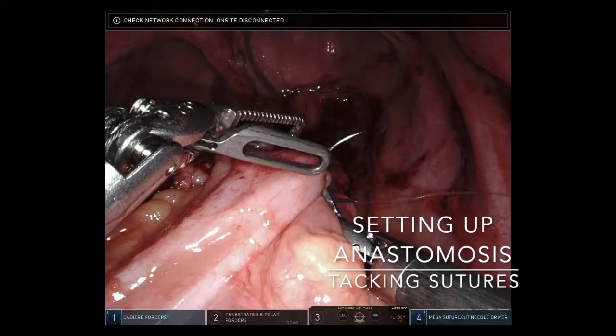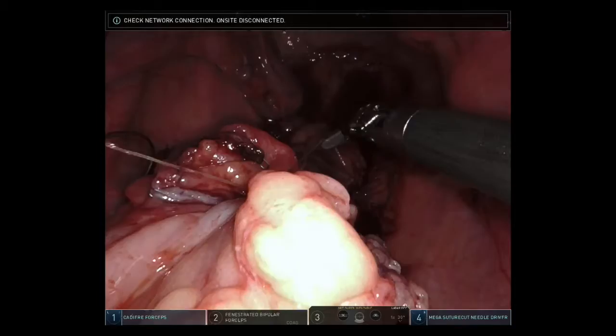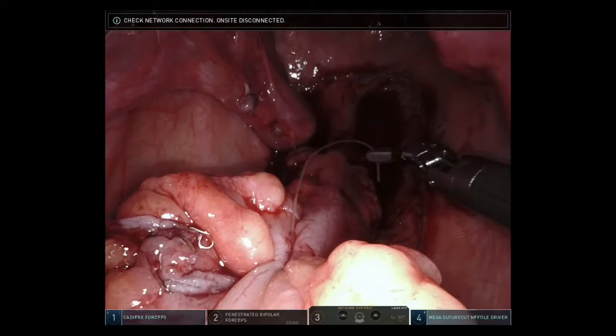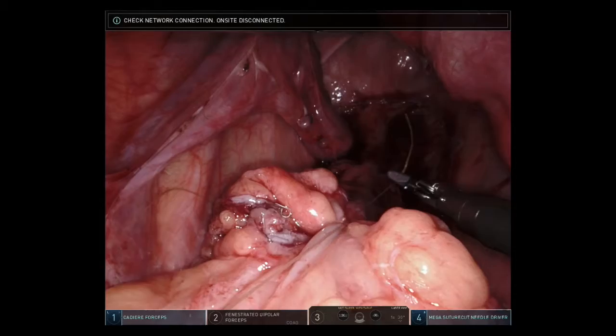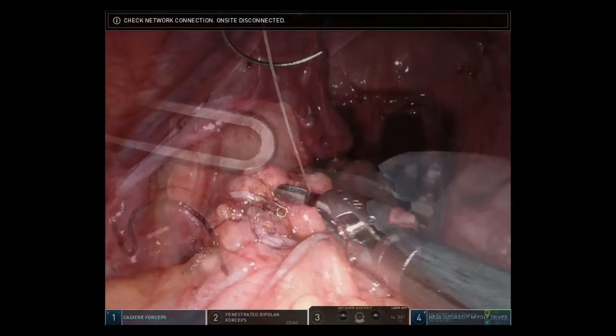Let's see how this played out in our patient. First, we set up the anastomosis by tacking the sigmoid colon to the rectum using 3-0 vicryl sutures. Three separate interrupted sutures were utilized to lay the colon side by side with the rectum to prepare for the intracorporeal anastomosis. The wristed instruments enable us to suture more facilely, especially as the anastomosis is located in the upper portion of the pelvis.